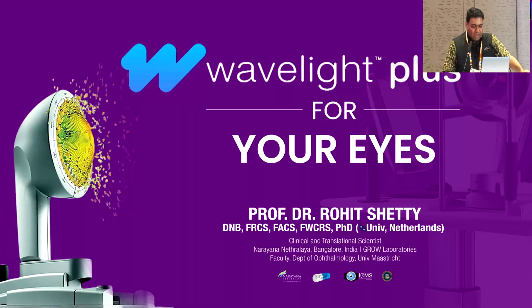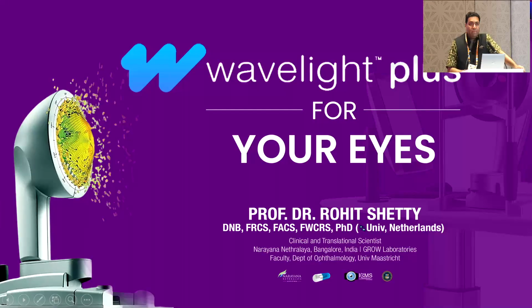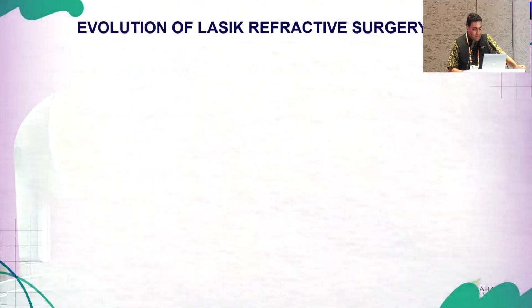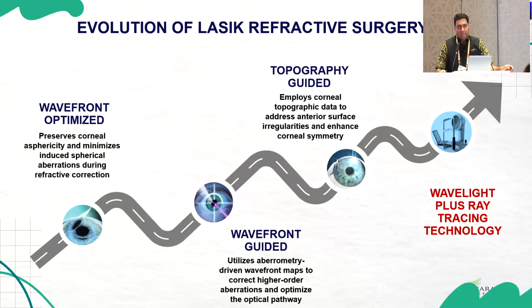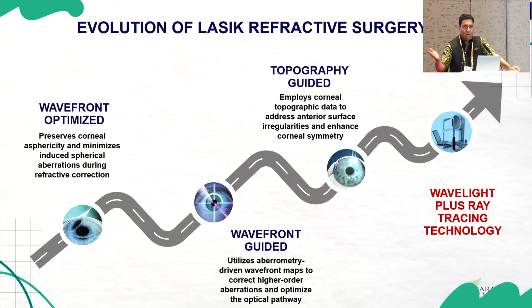Today, the topic given is the Wavelight Plus, which is something trending in refractive surgery for your eyes. No financial interest linked to this. I have been using this technology for close to a year now, and now it's introduced officially, but we have been using it for different other research activities.